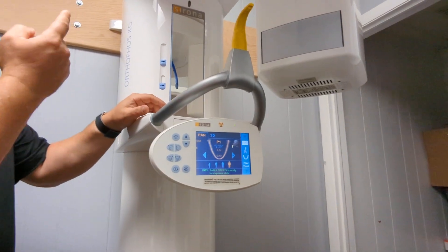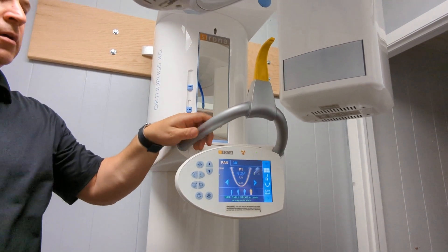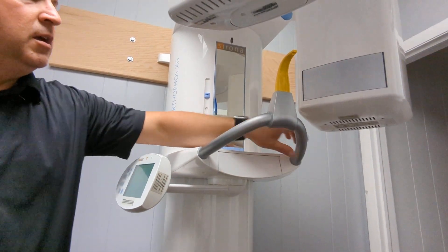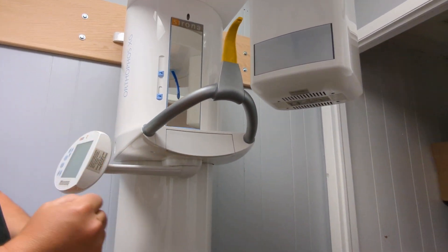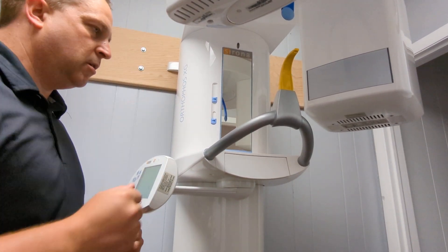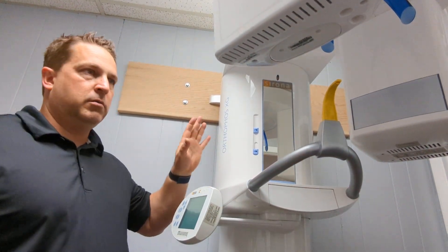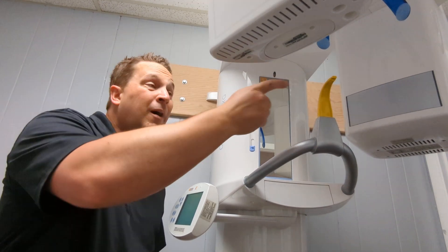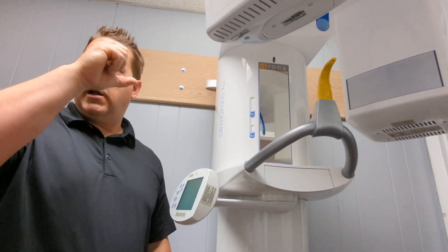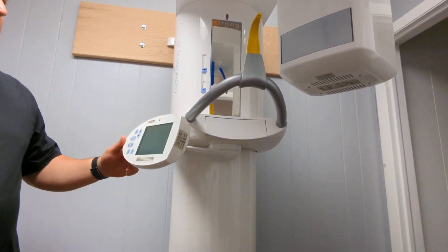When you take the panorex and you're done, the machine will automatically open and the patient can come out. Have them hang on to the handles. Feet straight, head straight, chin down just a little bit. And just kind of make them smile — make sure their teeth are on the bite piece, because class 2 and class 3 patients are like 'yeah I got it' and you're like 'no you don't.' Pretty easy operation.